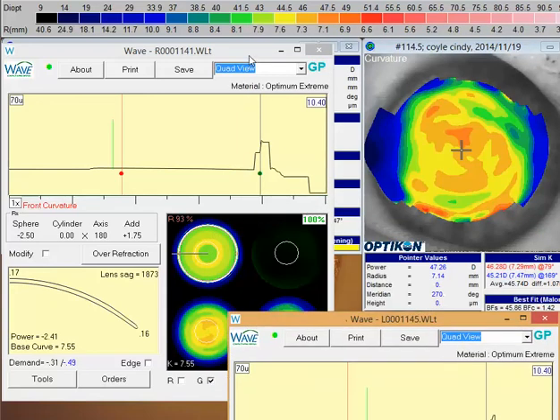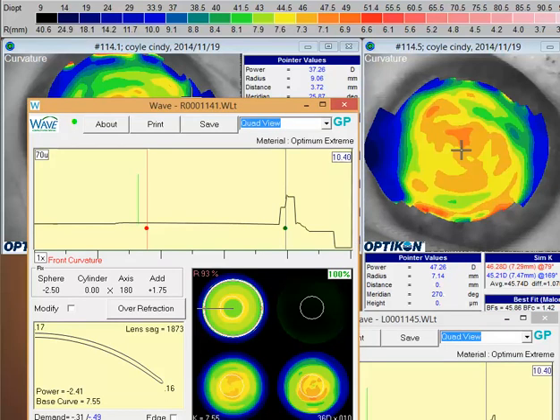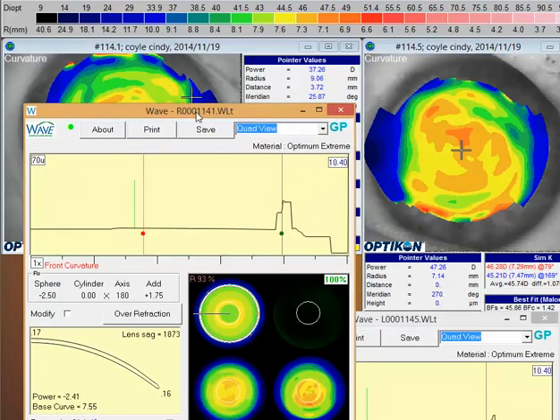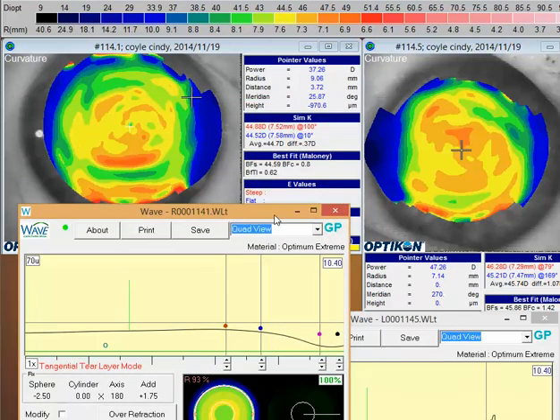Again, if you like the overall look for the most part, I would just go and click on tangential. That'll loosen the lens about a half diopter flatter. If you're trying to get those edge designs to match more nicely, remember to work on perfect topographies or as close to that as you can get. Sometimes I go to freeform just because it looks nice in the pictures, but the reality is you can have a little leeway on those edge lifts in the different meridians, even with the RSIM or the GSIM. And then I think it'll solve a lot of your dryness or filming up issues, and that may even help this lens center better.